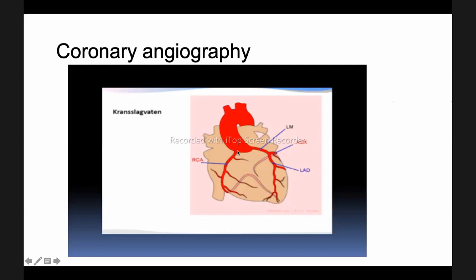You go to the right coronary. You engage it. Then you inject the dye into the right coronary to look at the lumen of the right coronary to see if it is okay. So if you can see a dye showing the whole vessel, it means that there is no occlusion. If you went here, for instance, and this is where the occlusion is, when you inject the dye, you'll only be able to see this part, but not the distal vessel, because the dye has not gone beyond the blockage. That is self-explanatory.